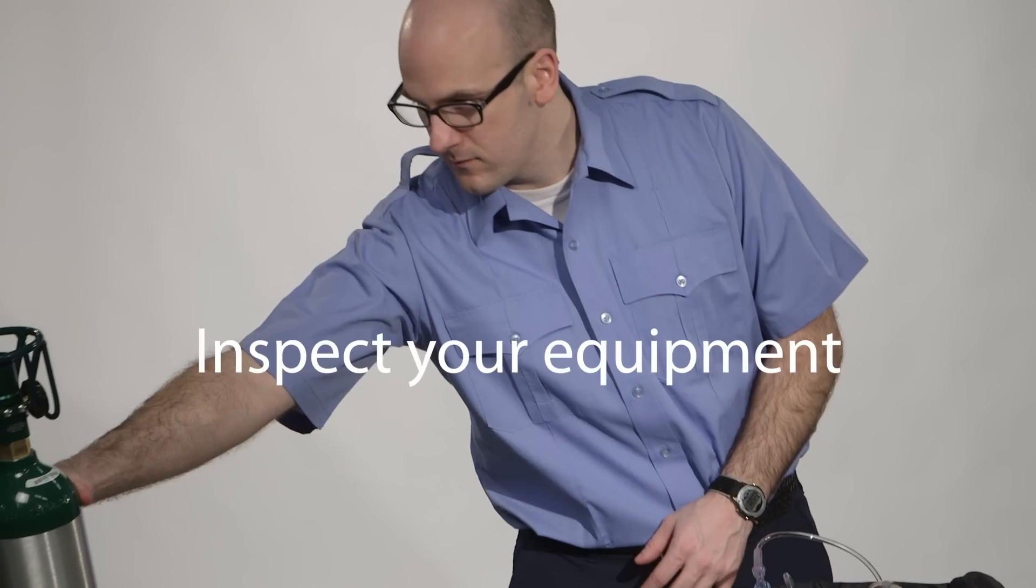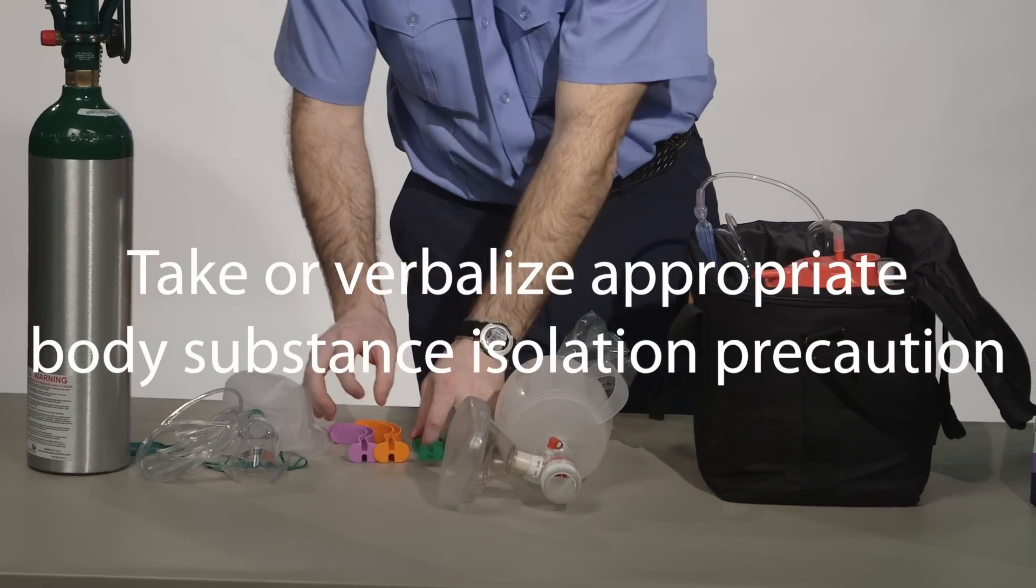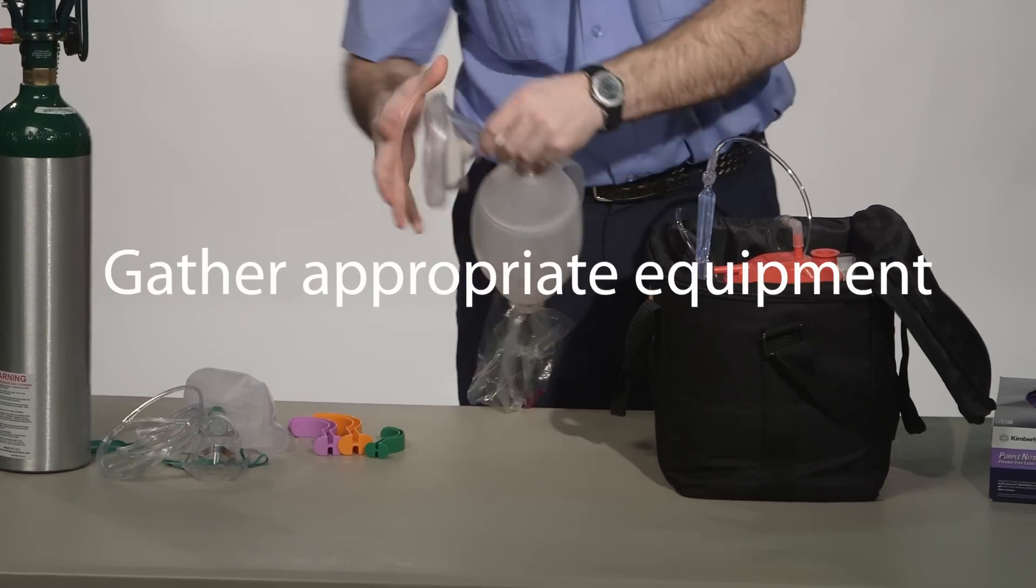Before we get started, I would like to go over a few things to ensure your success. First, the candidate must verbalize the appropriate body substance isolation precautions and gather the appropriate equipment.